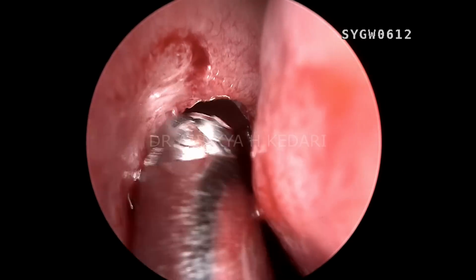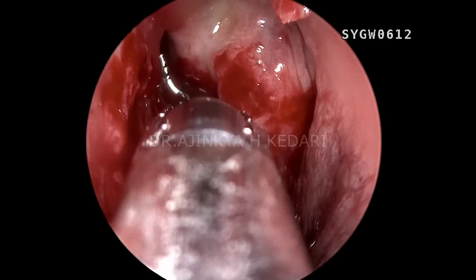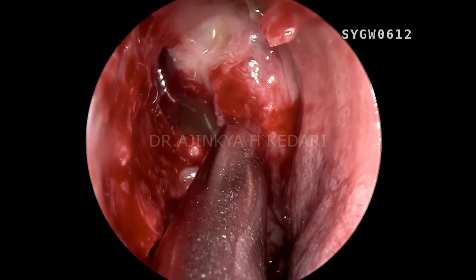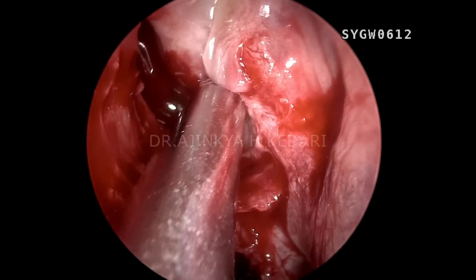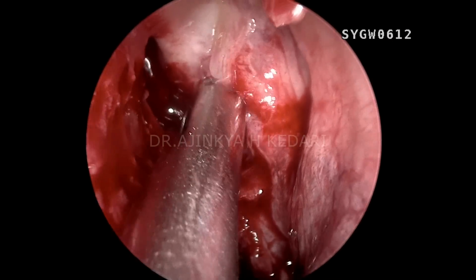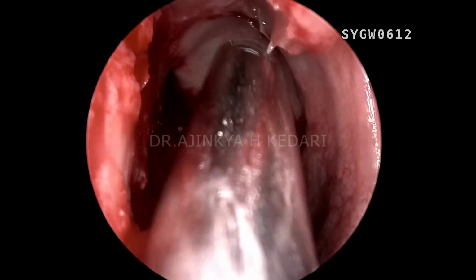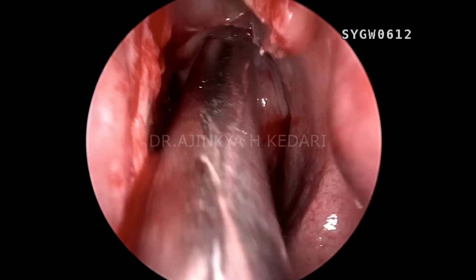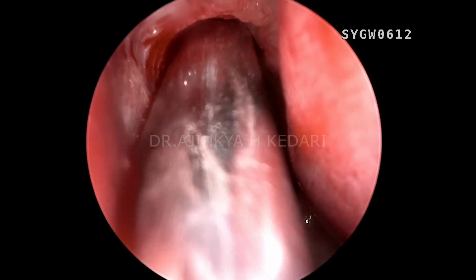I'm coming back on the axillary area, trying to take away all that soft tissue very carefully, not trying to damage any neurovascular structure. That is a remnant of the posterior ethmoids. You can see I'm trying to debride right now superiorly, with the active ongoing CSF leak happening from the frontal sinus area up there.